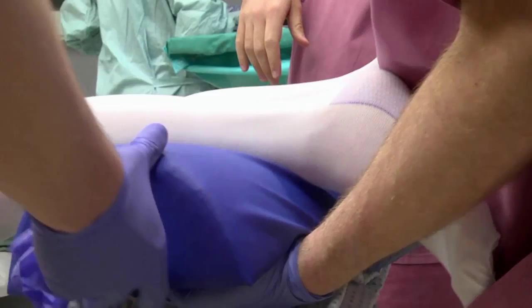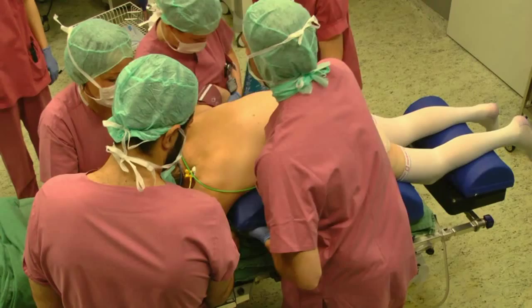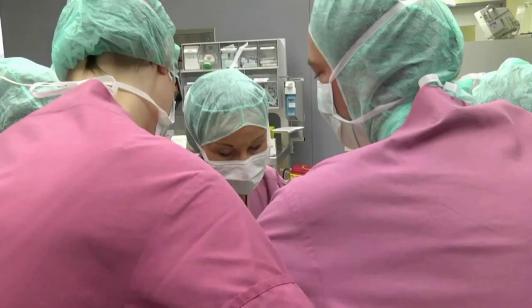The patient is placed in prone position on an adjustable table. Because of the local kyphosis, the position has to be adjusted. By placing the patient in prone position, a sufficient reduction is already achieved.